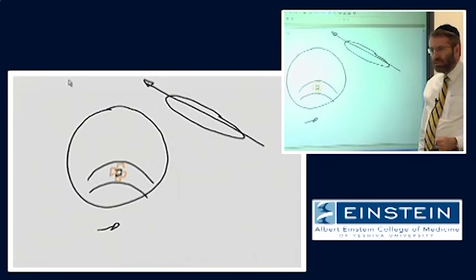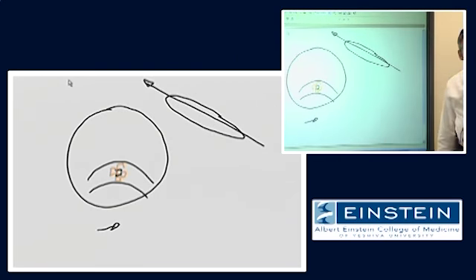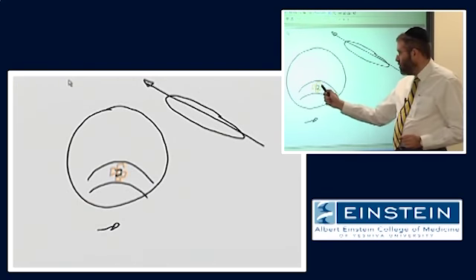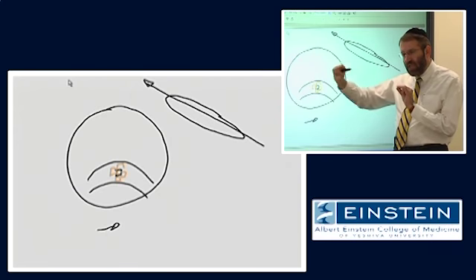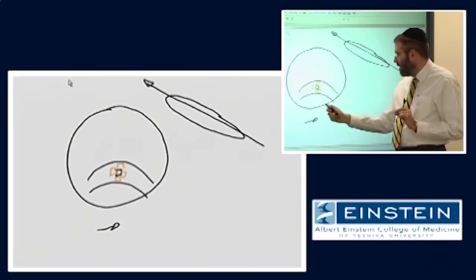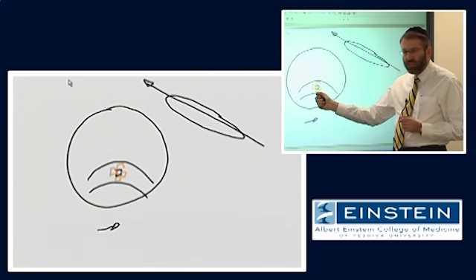And then if we look at a bunch of surrounding voxels, let's look at the orientation of diffusion at each of those adjacent locations. Do we find that there is a streamline or end-to-end association of the orientation of diffusion at our initial spot, which we could call the seed location, and those adjacent?